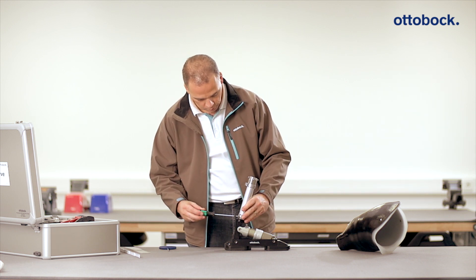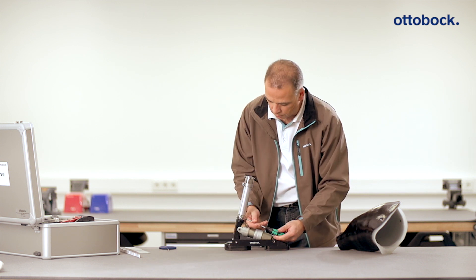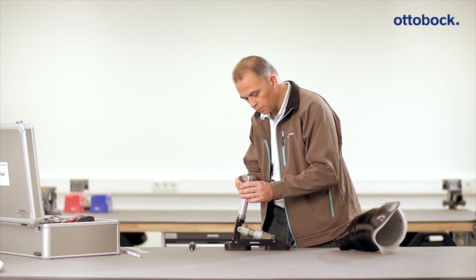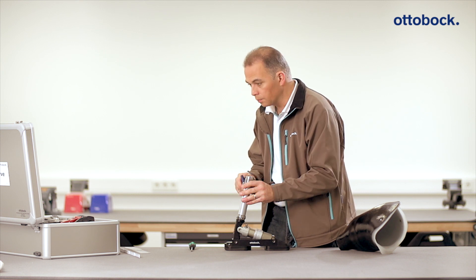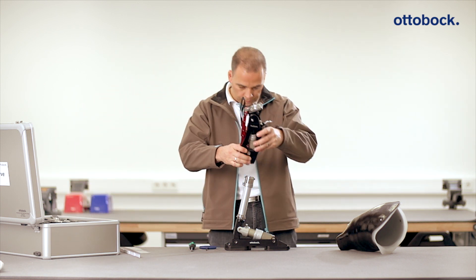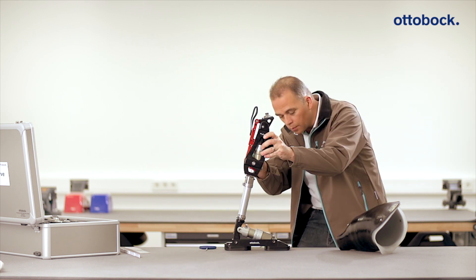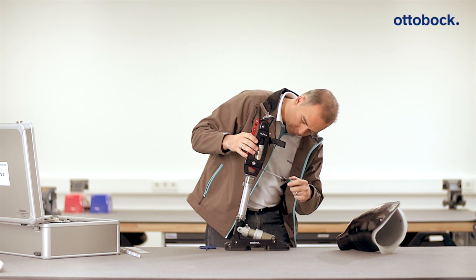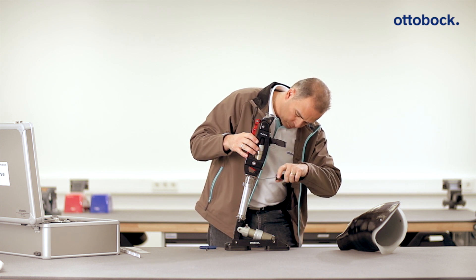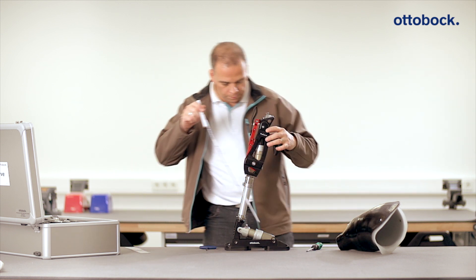An example of this alignment is shown here for a transfemoral ski prosthesis. Remove the required adapter from the testing case in order to connect the Pro-Carve prosthetic foot to the Pro-Carve prosthetic knee joint, and attach the prosthetic knee joint according to the instructions for use. Position the alignment reference point — the axis of rotation of the knee joint — at the height of the medial tibial plateau to floor measurement determined for the patient, plus 20 millimeters.